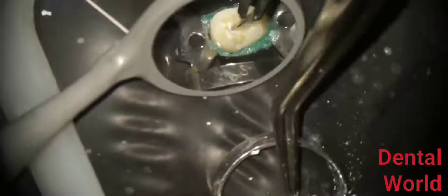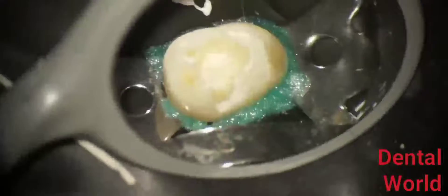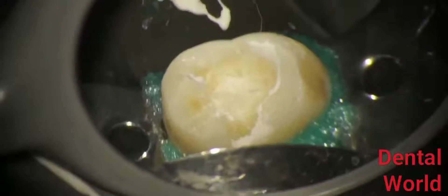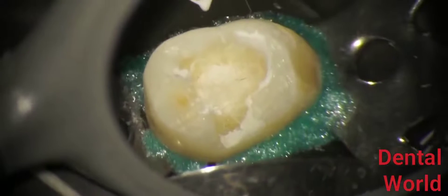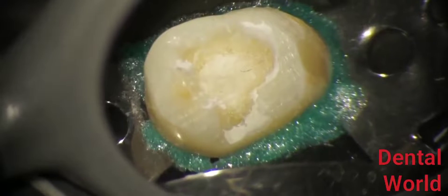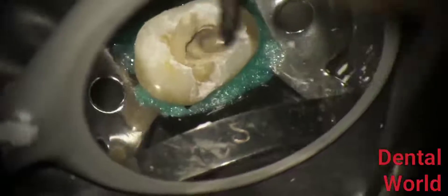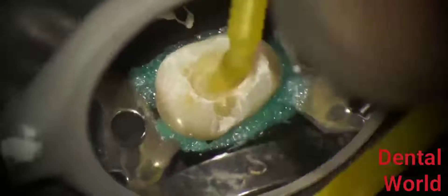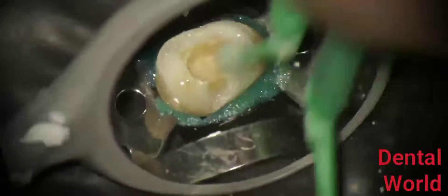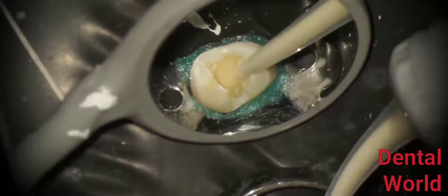A lot of people like to use cotton after placing calcium hydroxide — plugging cotton around it and then covering with temporary. We don't use it because if you zoom in, you can see those cotton fibers tend to stick out and act as capillary tubes to draw saliva into the canal, which can contaminate it. Instead, we plug Cavit G directly above the calcium hydroxide straight into the canal, applying pressure with a plastic filling instrument. This can be easily removed with ultrasonics during the second visit. We then apply pressure with a wet micro brush to plug the Cavit into the canal, and we cover the Cavit with glass ionomer cement as a temporary filling material.